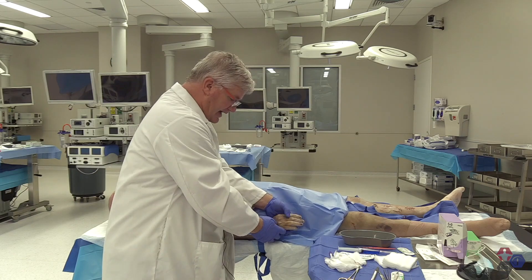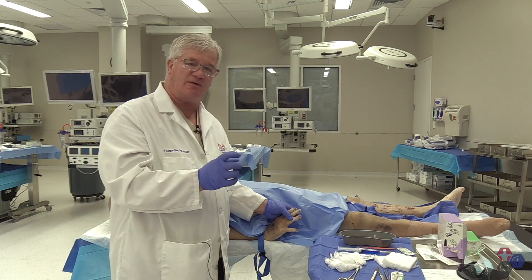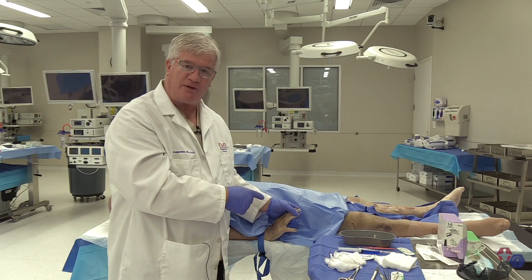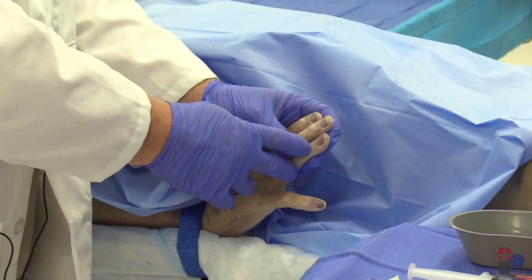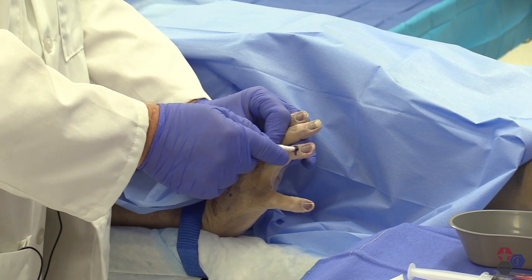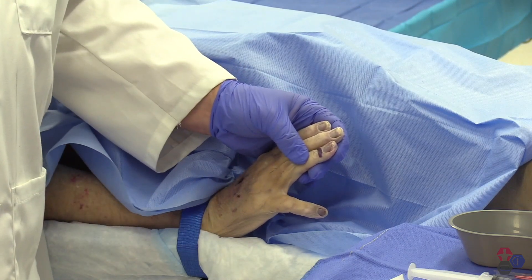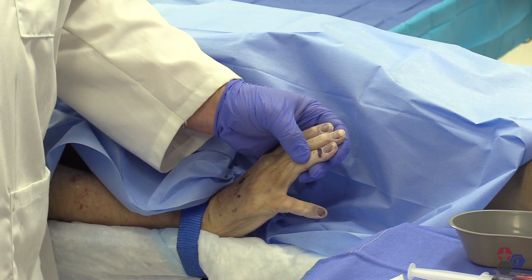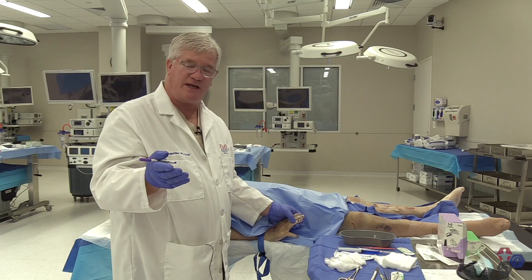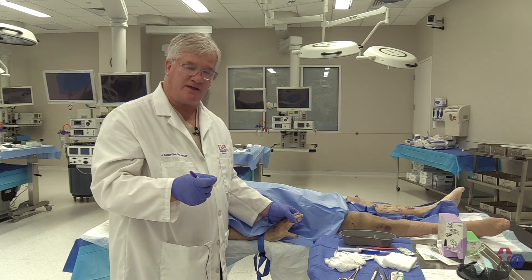Another very important part of hand functionality is the nails. Any involvement of the nail bed requires evaluation of the nail bed itself, the damage to the nail, and potential damage to the nail matrix — the base area from which the nail grows. If there is a laceration or wound into the nail matrix, evaluate with the patient what functionality is needed from their nail. In many cases, we remove the nail, clean it up, and replace it, with the patient understanding there may be long-term damage to the nail matrix that cannot be visualized.